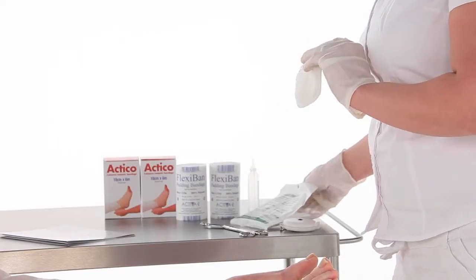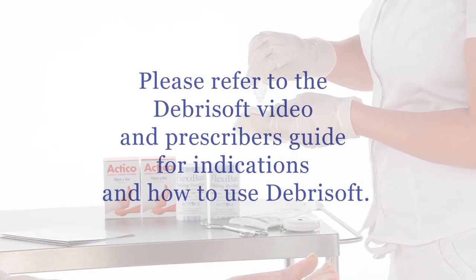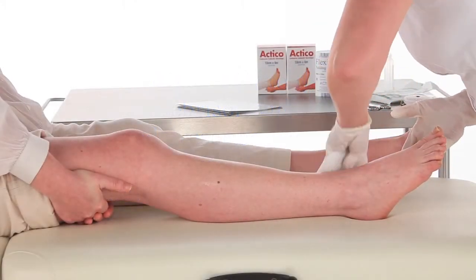Here you can see the use of Debrisoft, which is indicated for hyperkeratosis, wound cleansing and debridement. Please always refer to local guidelines.